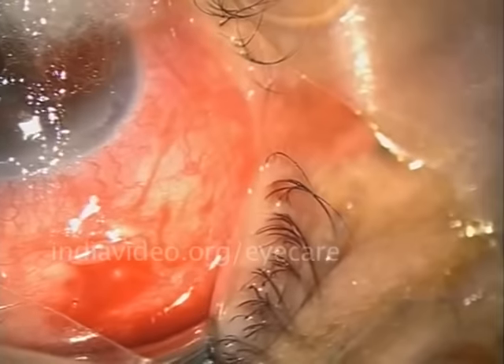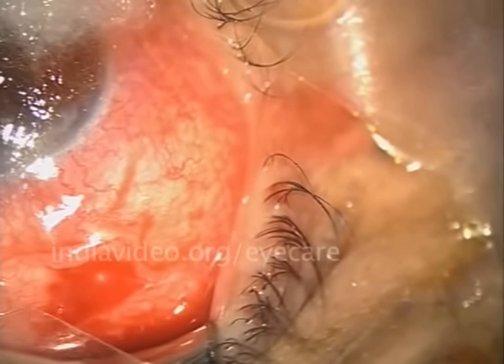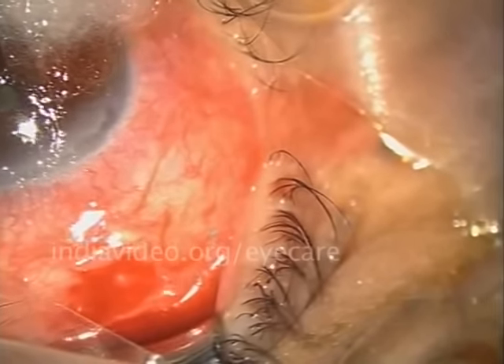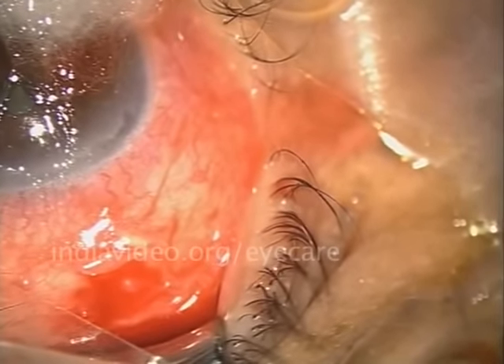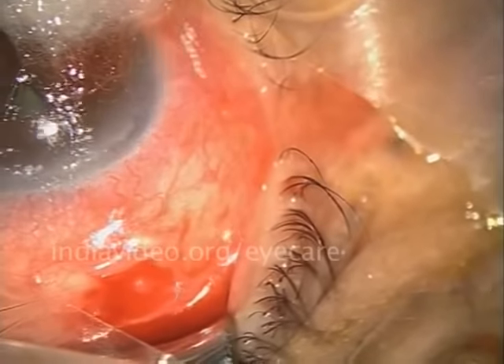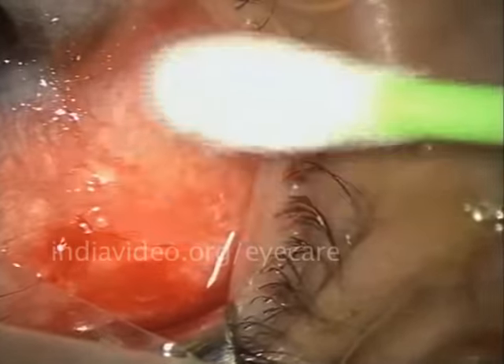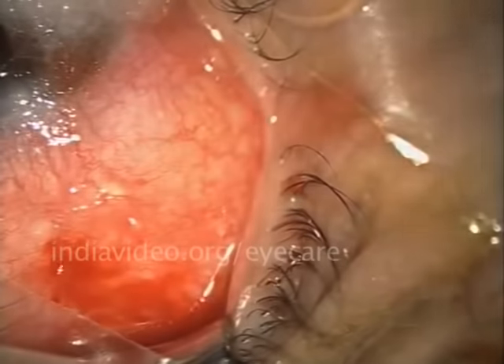I have taken it out — it goes into a glass bottle for safe keeping. All that remains now is to reassure the patient that I have taken out everything and then close that tiny wound. It does not require any sutures because it is a very tiny wound and will heal itself within 24 hours.